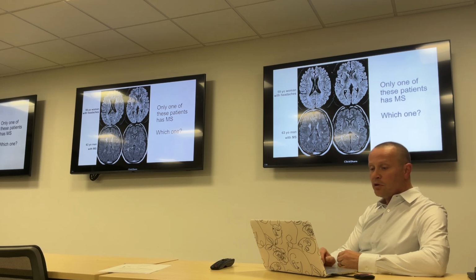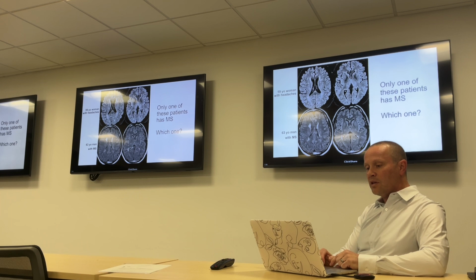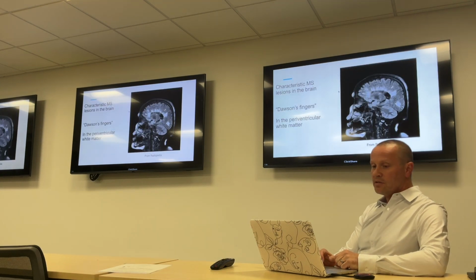The bottom patient, similar age man who had MS, and I would have been able to say that this is more likely to be MS, and some of the lesions are kind of characteristic of MS, but not of those other processes. You don't get white matter disease nearly as frequently in the corpus callosum, and this is the right side of the splenium of the corpus callosum. This kind of blotchy signal next to the ventricle, especially if we saw it in another plane, would not look the same as the little white matter lesion here, even though they look very similar in the axial images. So a lot of that comes with looking at a lot of these pictures and sort of learning the patterns, but you can kind of also look for specific patterns of white matter disease.